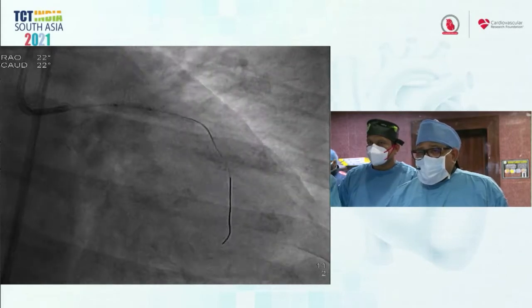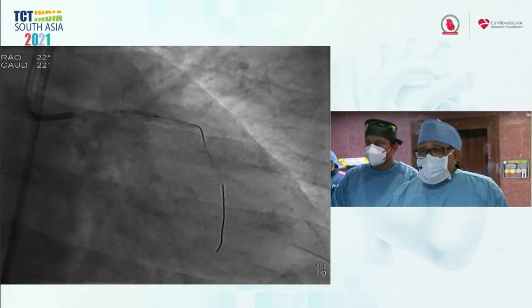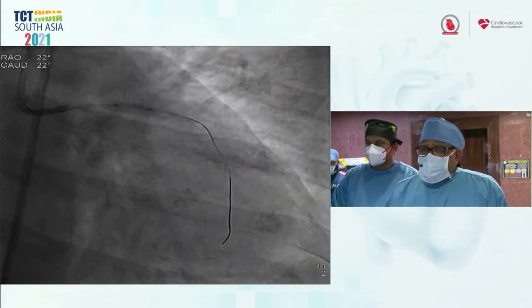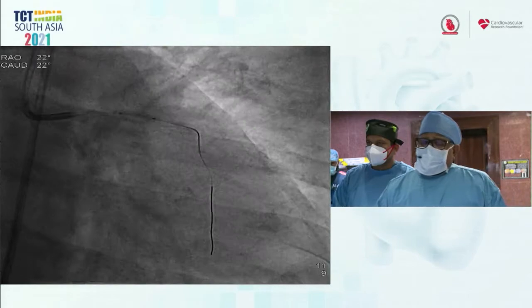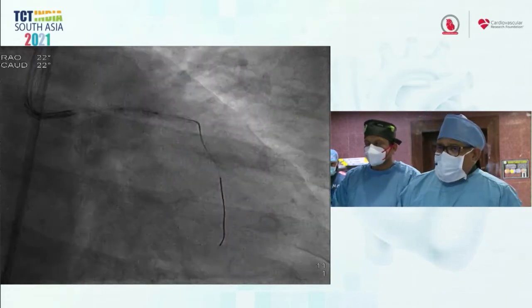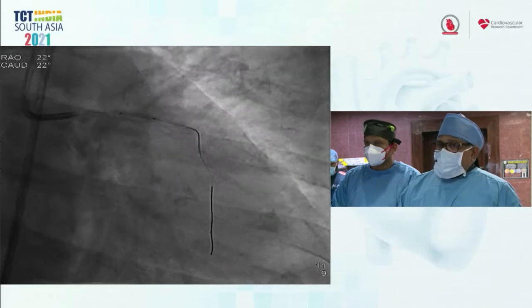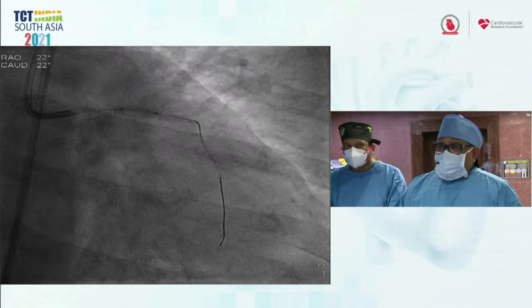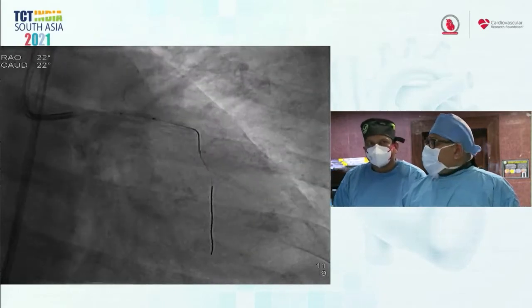There was a need to further dilate the LAD, whether it's a cutting balloon or IVL therapy. So I chose to go ahead with, say, a 3.5 millimeter cutting balloon across. It's a 3 millimeter Wolverine cutting balloon from Boston, with which I had dilated the LAD and also the left main. Next view, please.